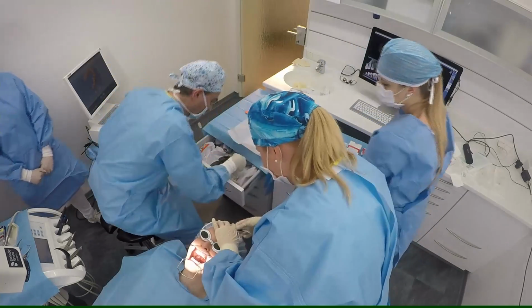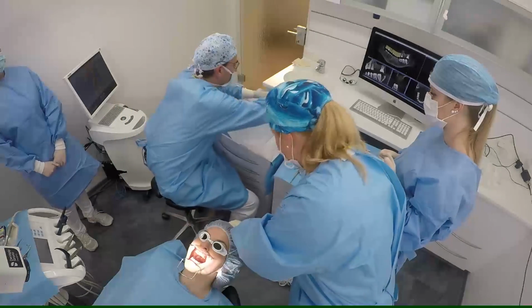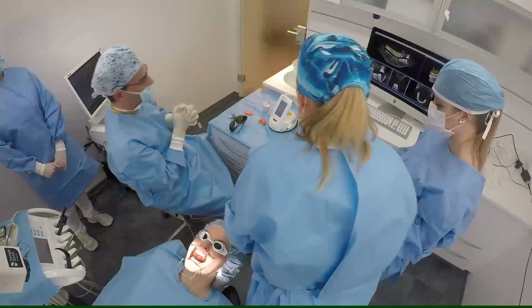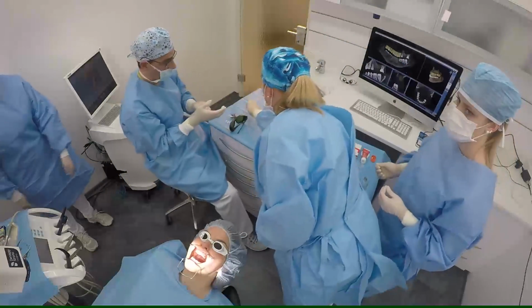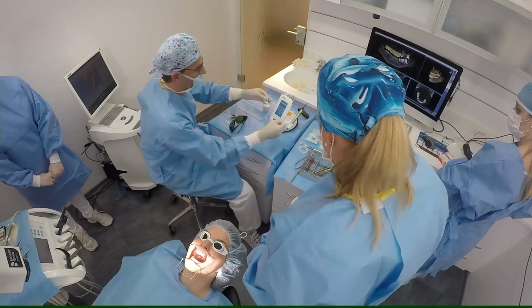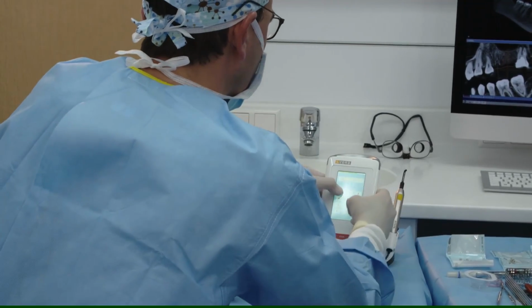So we will switch now to the laser. The patient gets some fancy glasses. Do you see that? Everything? Yes. Okay, now you see the laser.